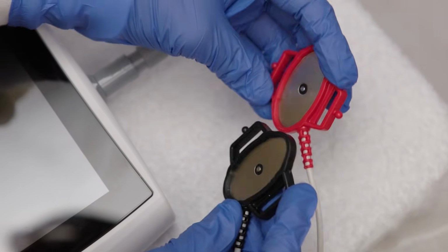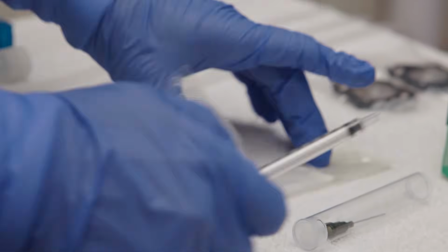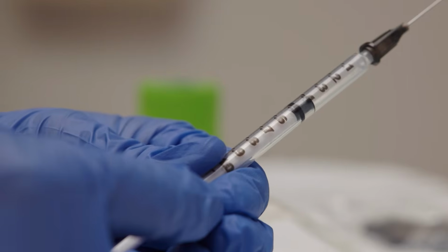Inspect and clean the electrodes with alcohol wipes, rinse with CLRW, and dry. We will be using a syringe for the collection process, which can be prepared ahead of time as well. Begin by attaching the blunt needle to the syringe. Pull the plunger back about halfway.